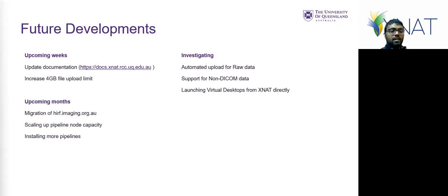Long term, we are looking at automated upload for raw data. It's been a common request. There are some challenges in doing it on an operational level, so we're looking into that option, and native support for non-DICOM data. It's been a strong interest, so we're going to see what we can do on that front. There's a couple of clients and things that can do a bit of this work, but we have to test this on our server.